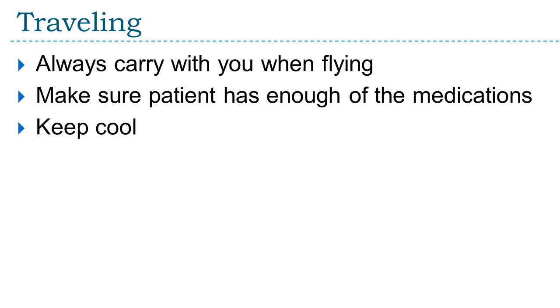They only use rapid-acting insulin, and the common risk is obviously ketoacidosis. Most of the insurances will cover the cost of pumps. Some of these pumps can go as high as $1,200, $2,500, just depend on the sophistication of the pump and exactly what it does. But it's always important to know that if some complication or malfunctioning of the pump occurs, that the person has the education and the knowledge to be able to remember to inject themselves or know how to inject themselves with syringes and have that equipment available for a backup. Okay?